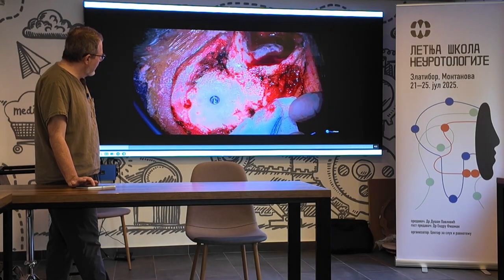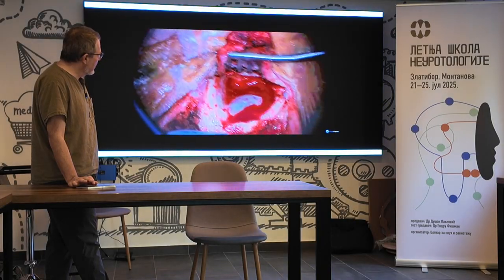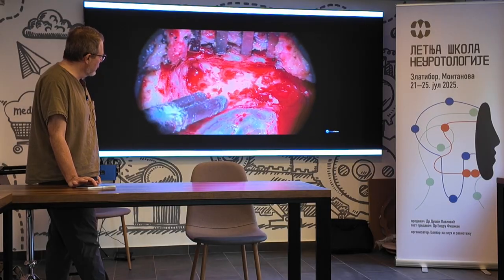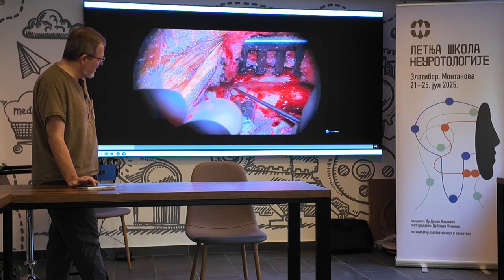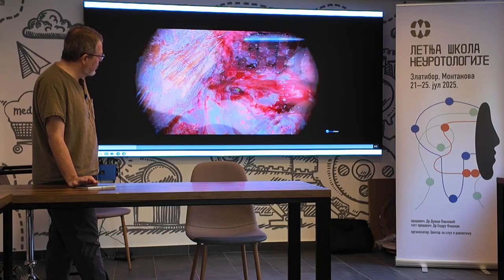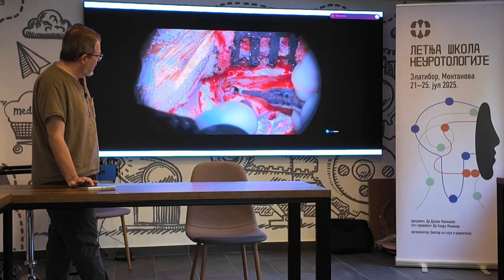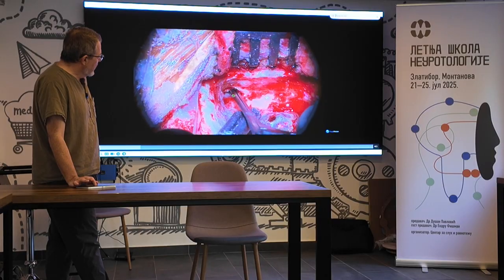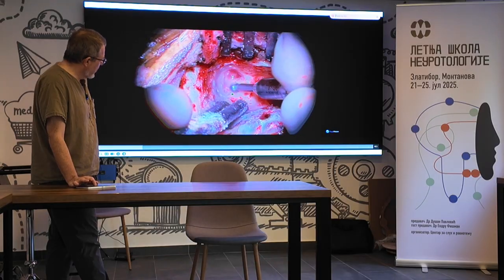So we put an osseointegrated bone implant in, get that all done, and then I'll do this as a single stage because it's an entirely sterile operation. So there's no risk to putting in a foreign implant. Because I'm opening up into the CSF space and we're going to section the cochlear nerve, I can plug the eustachian tube off because we're not going to be using the natural hearing anymore. So I'm opening up to plug the eustachian tube so we don't get CSF otorrhea. Cutting the tensor tympani tendon so I can put muscle in there.